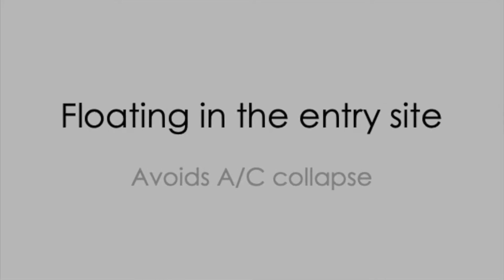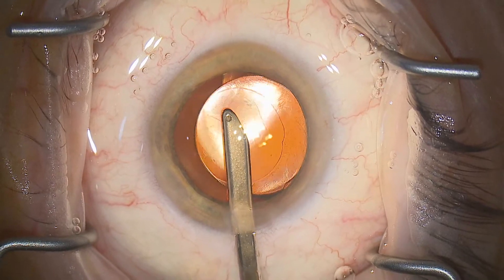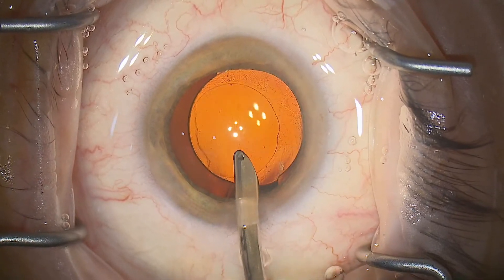Remember, we're always floating and pivoting in our entry site, avoiding posterior pressure. This avoids collapsing the AC. We're going to see this in slow motion here with those creases appearing in the cornea. We want to avoid that, or worse still, iris prolapse.